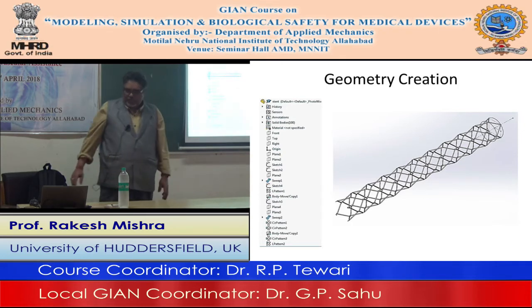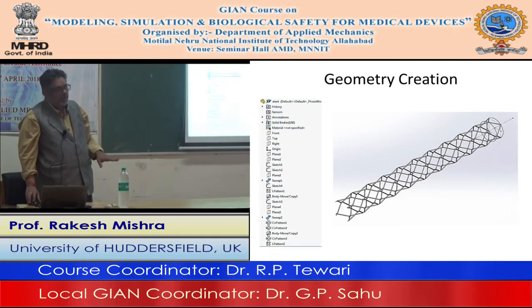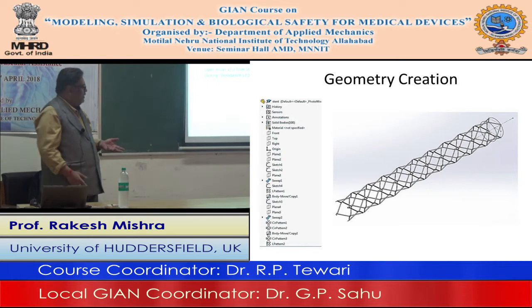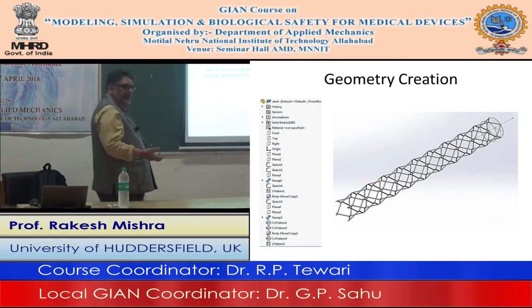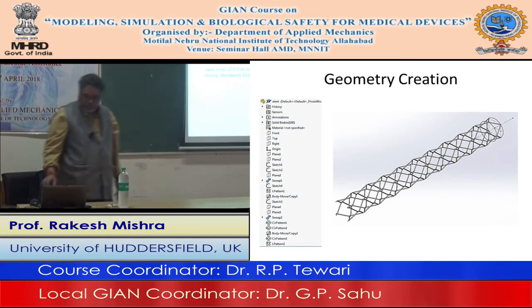So what we do is, we create this stent using SolidWorks, and then this file is imported into Design Modeler. Okay, so this file is created. Suppose you're working on a stent with a manufacturer, ask the manufacturer for the CAD, save it as an IGS or parasolid file, and then you can directly import it into your Design Modeler. Okay, so that is what we are going to do here.